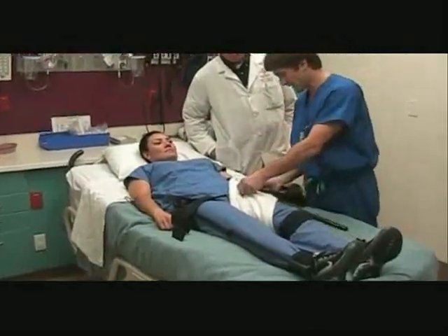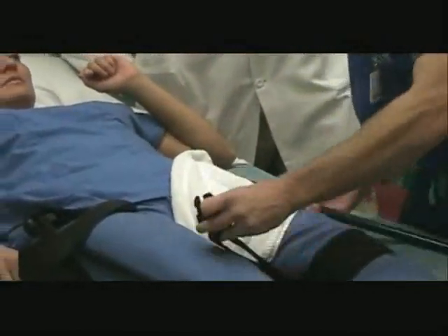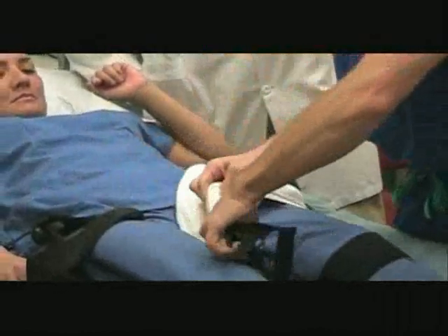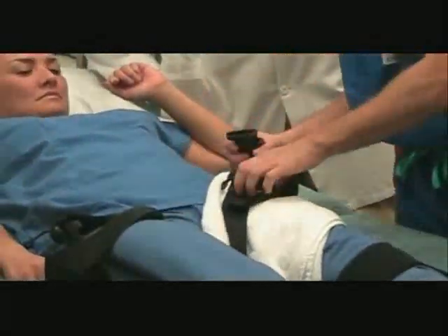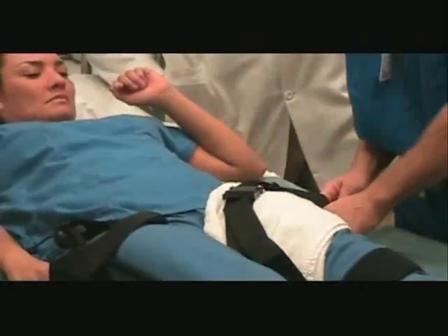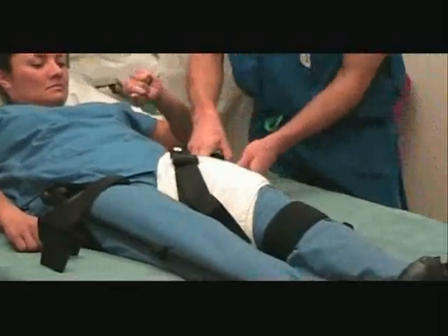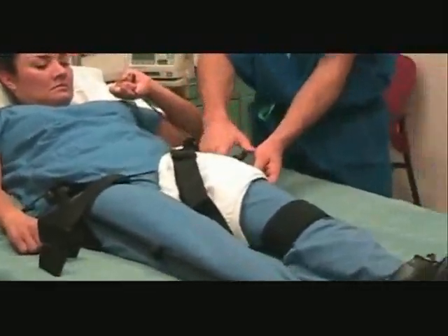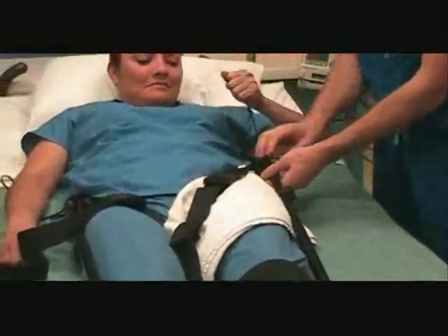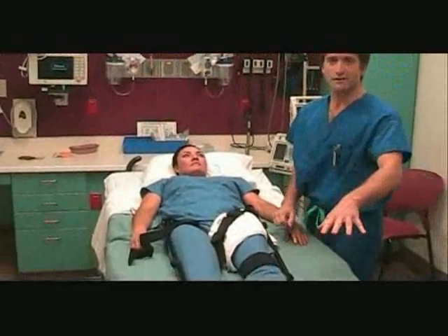Again, the female buckle sits anterior to the thigh. Now this is the coarse adjustment — don't pull yet. Lock that in place, and then now we can pull this together, lock in place, and she has traction on her femur despite lack of a foot.